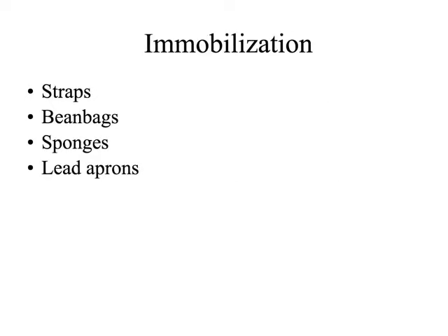Okay, immobilization. So the ART calls this immobilization. I do not use the word immobilization or the word restraint. I say support, and I think that comes from working in radiation therapy for 5 years. Now, granted, support may involve me with you in a headlock, and I'm supporting you through your CT scan, right? I'm willing to support you in that way. But I do not immobilize anyone.